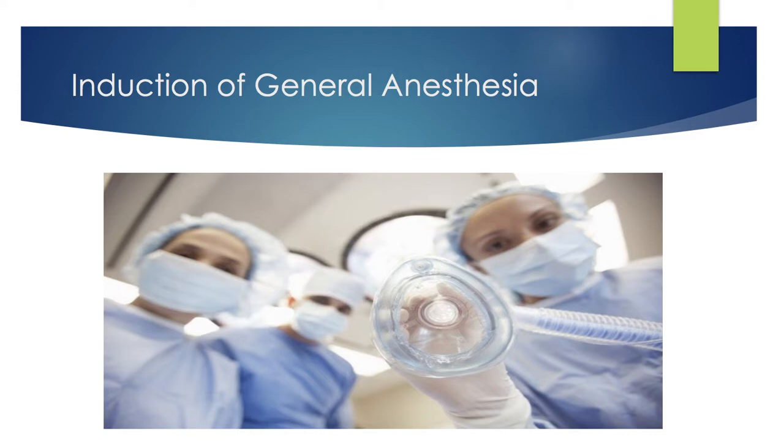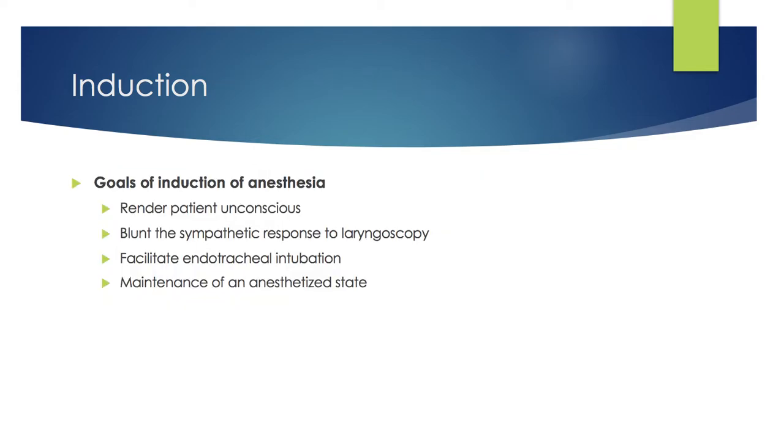So, moving on to the actual induction sequence. The goals of the induction sequence are to render the patient unconscious, blunt the sympathetic response to laryngoscopy, facilitate endotracheal intubation, and to maintain an anesthetized state.